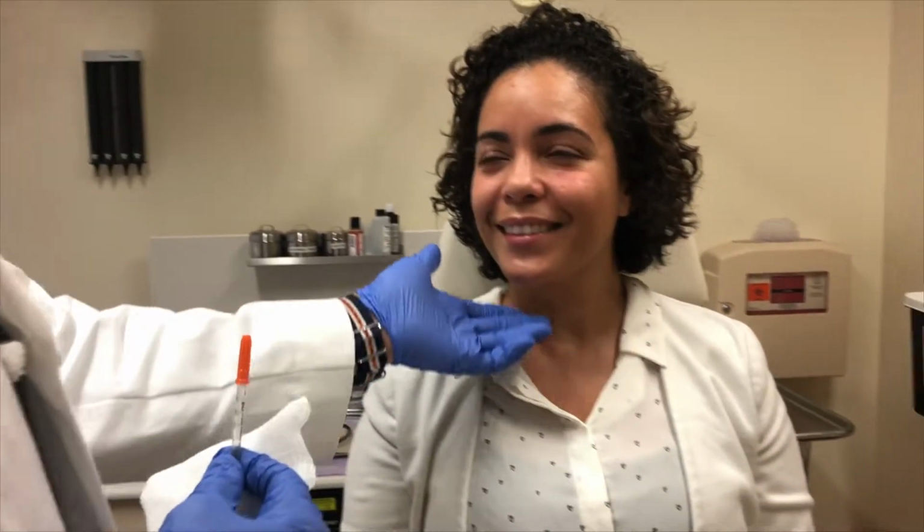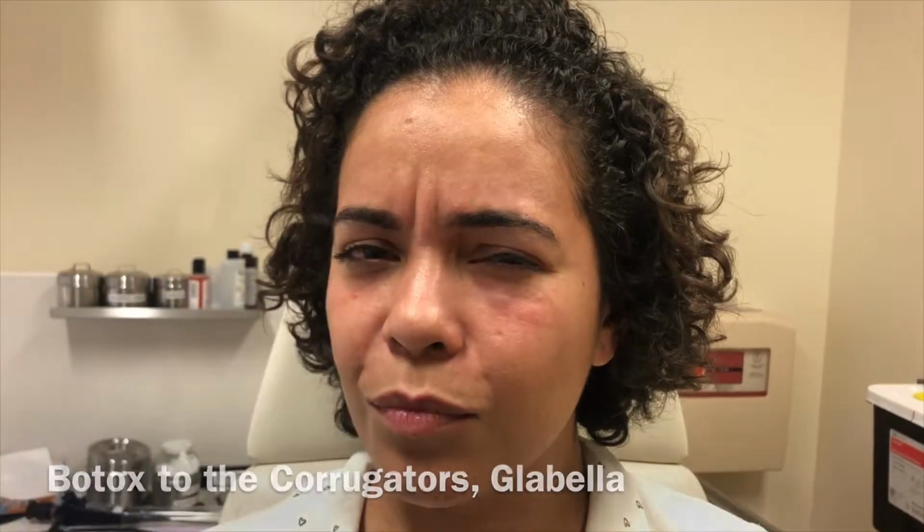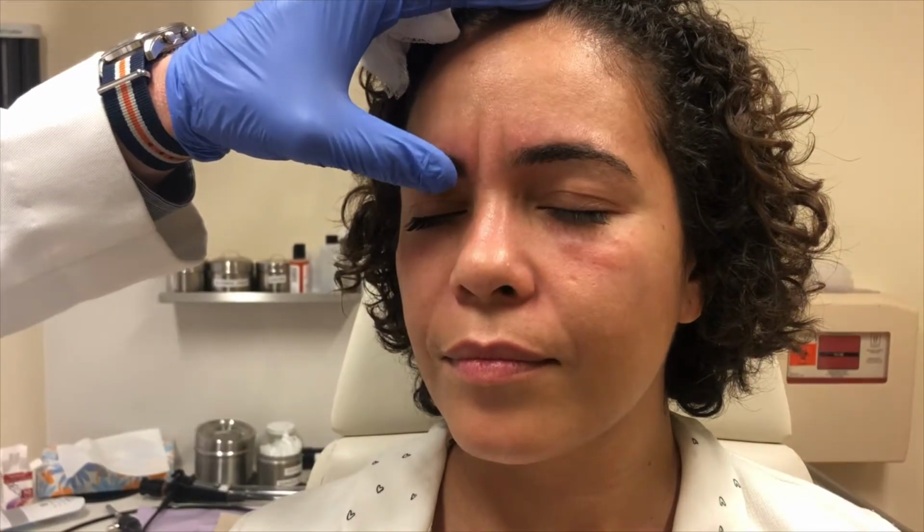And now we're going to be doing a little bit of Botox here, so if you could raise your eyebrows for me again. Good. You can see a little bit of the horizontal rhytids there, wrinkles we're going to get rid of. And bring your eyebrows together. And then a little bit of the angry 11s. Not too bad, but enough to put a little smidge of Botox there. So why don't we start out with the angry 11s. And so bring your eyebrows together again for me. Great. And so I've already sterilized the area. You can relax for me.